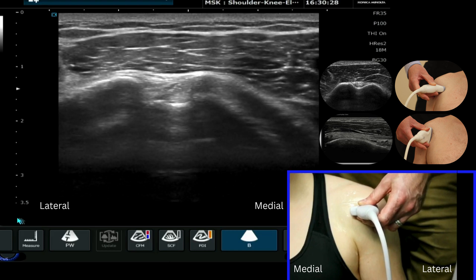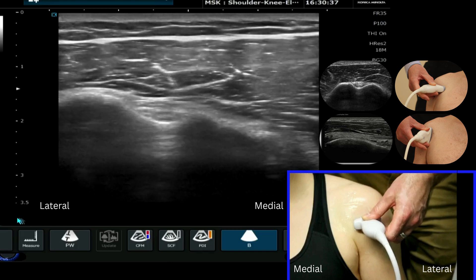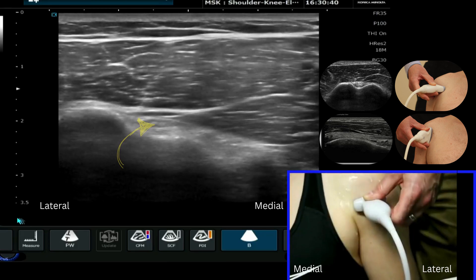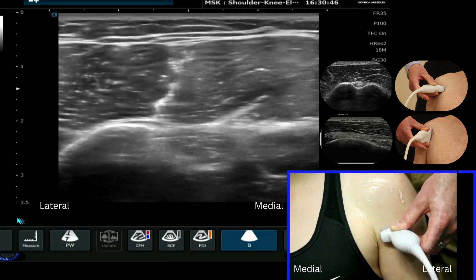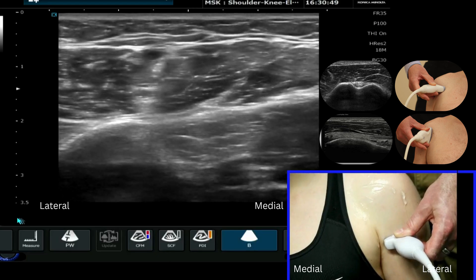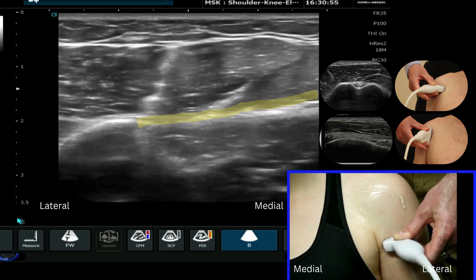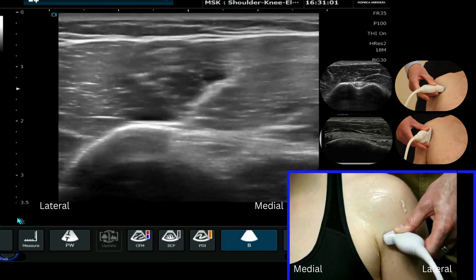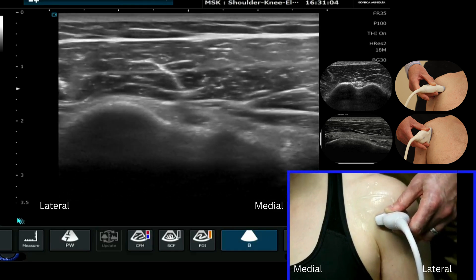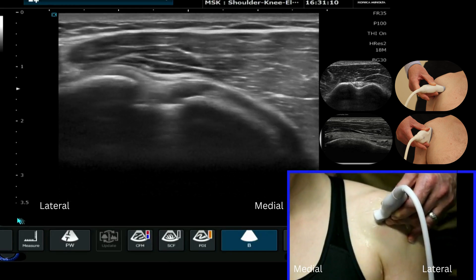So I make the long head of biceps tendon bright in the bicipital groove, and I'm going to keep it bright by very slightly moving the probe as I track down, keeping going down into the anterior recess until I see this hyperechoic structure coming across from the medial aspect — this is the pec major tendon, just highlighted on the screen there. I'm then going to come back up into the bicipital groove keeping that long head of biceps tendon nice and bright and track back up towards the rotator interval.